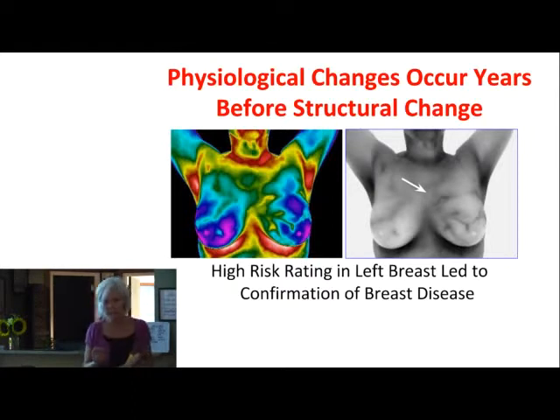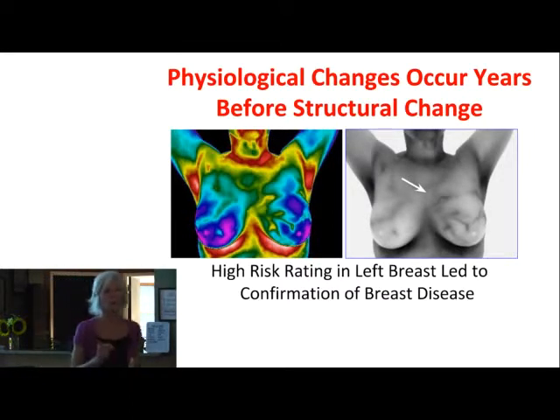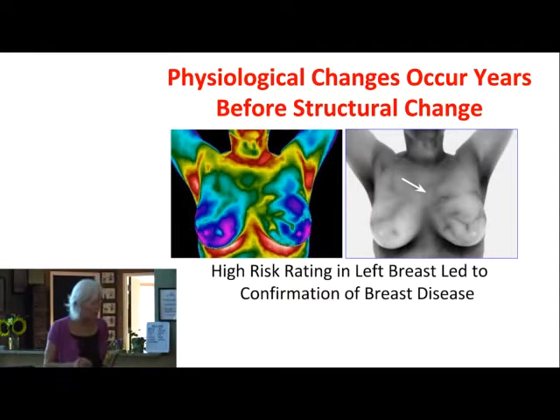But I do tell women this, if you decide to correlate with another screening, make sure you pick the one that's most appropriate for you. When I say that, have any of you heard about breast density and breast health and how that affects? Okay, mammography. Who's heard of this? Mammography is effective for 50% of the women who do this screening. For the other 50% who have the extremely dense or heterogeneously dense breasts, they can't read the images.